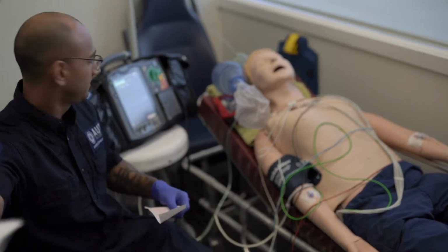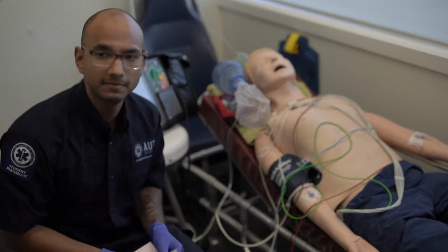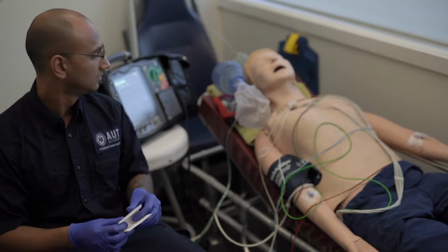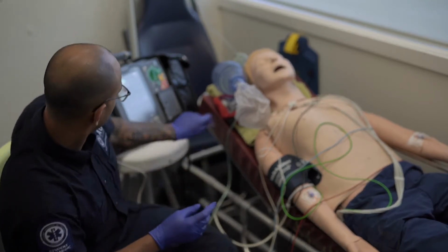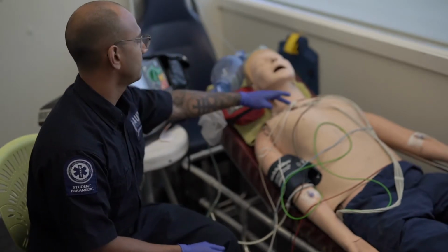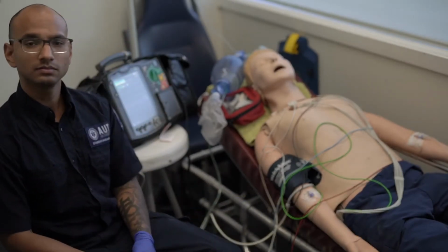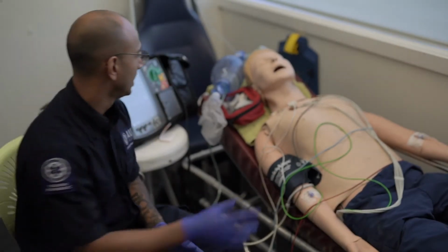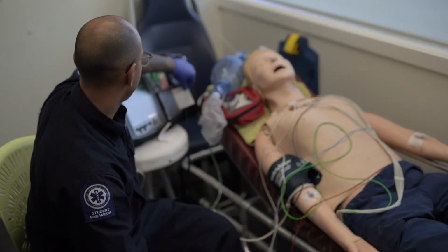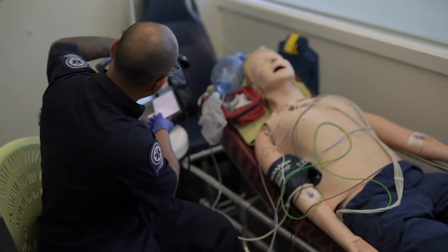Page 127. Alright. Place pads in either the apex or sternum or anterior posterior position. Yep, we have pads placed in the sternum and apex. In addition to ECG electrodes. We've got all our ECG electrodes previously attached and printing out another 12 lead ECG.